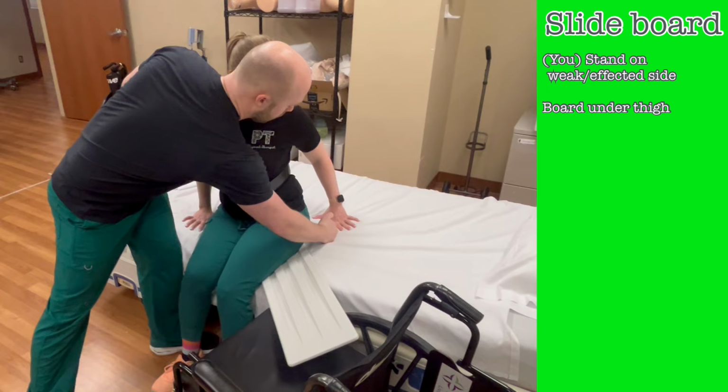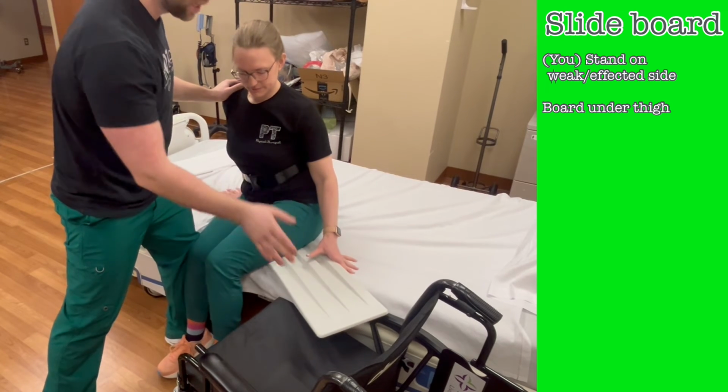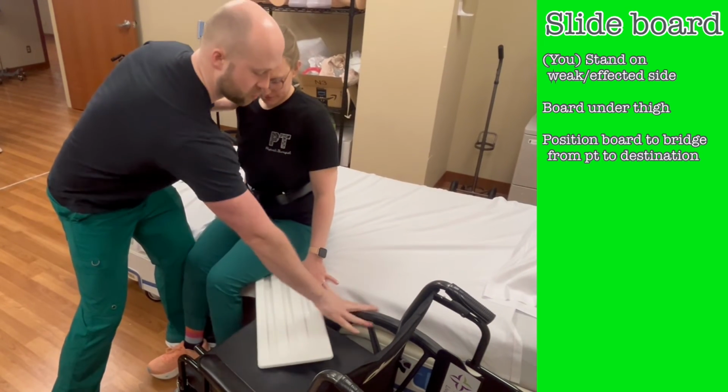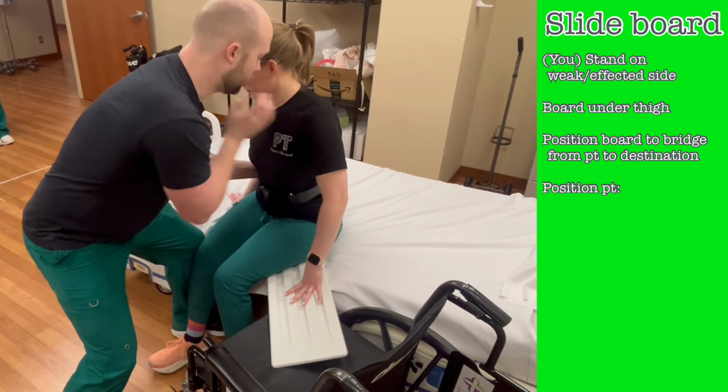If the board is under the thigh, the patient's weight is more evenly distributed front to back as they perform the transfer. If you're transferring to a wheelchair, as we are here, turn the board so it clears the wheel and is resting on the seat. As the patient slides, the technique is the same as for a lateral scoot.